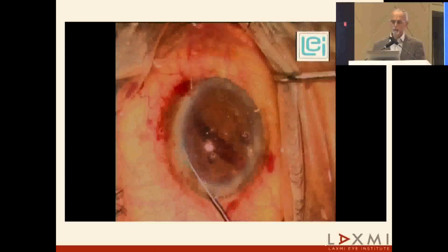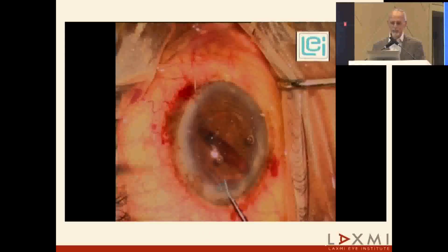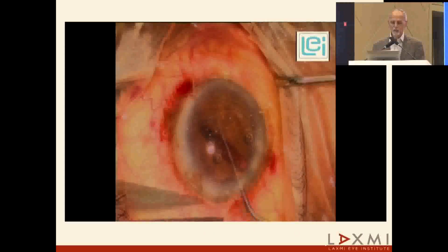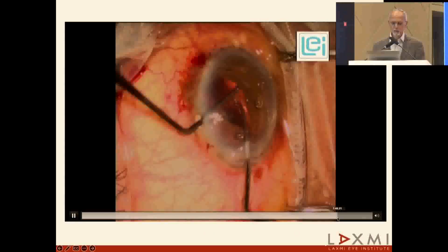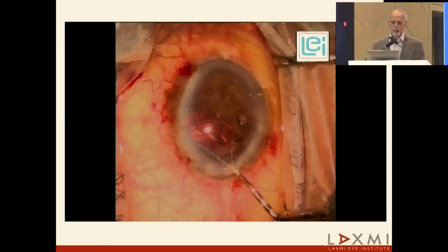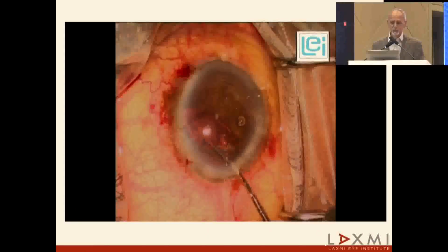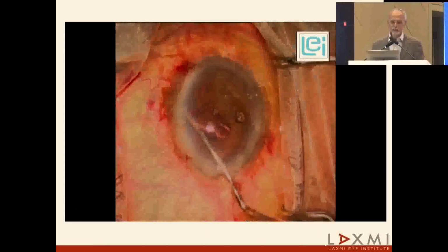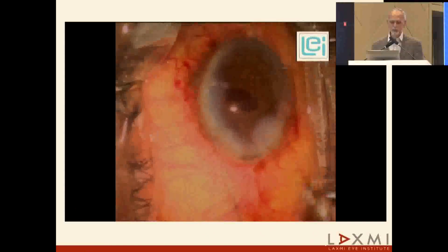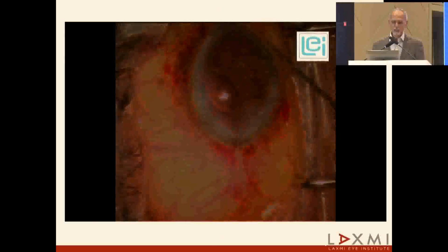Once the sutures are placed, you can push back the optics and you get a circular pupil. Whatever vitreous disturbance or the visco, you can always remove. Sometimes you get a circular pupil, sometimes you may get a peaked pupil, but with practice you can always get one.